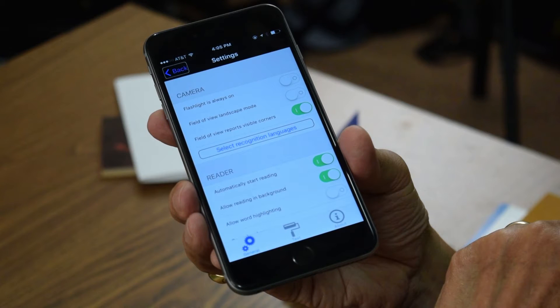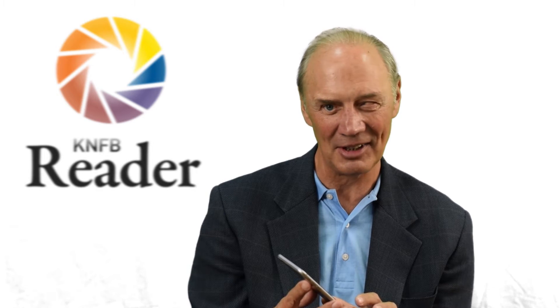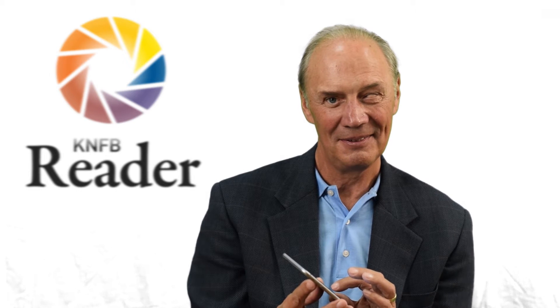Now I've got quite a few different settings options and we're not going to cover the details of all of them — you can do that on your own just to help you explore. Settings is the heading at the beginning, and Camera Settings is the first subhead. Flashlight is always on — switch button off. You could turn the flashlight on; it might be good for people with low vision in low light, but normally we would leave the flashlight off. Besides, it chews up batteries, so you may not want to turn it on unless you have a power source.